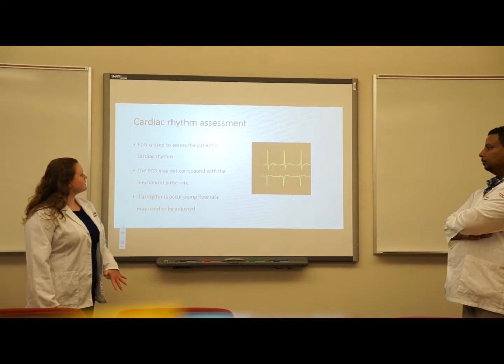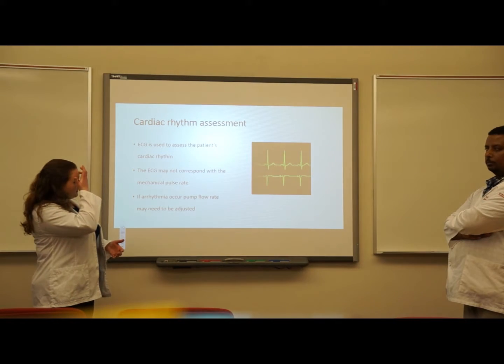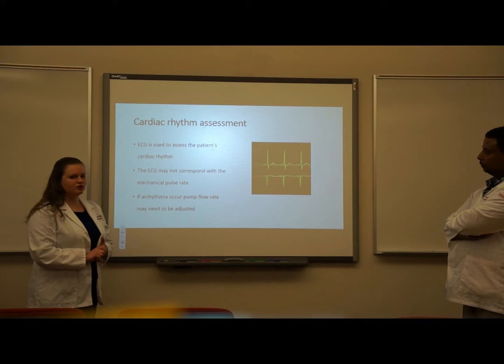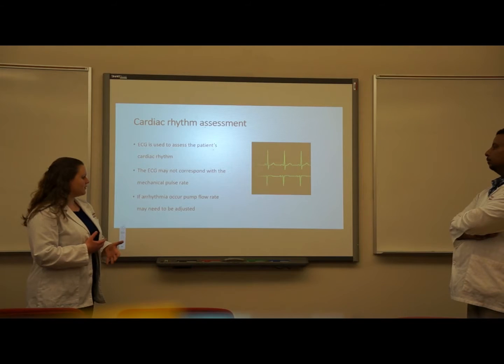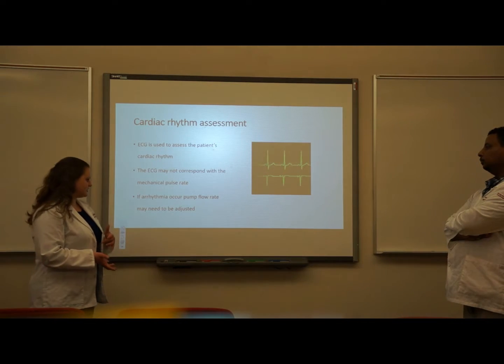Cardiac rhythm assessment: the EKG and the patient's actual heart rhythm will match up. However, the EKG may not correspond with the mechanical pulse of the pump. Arrhythmias can occur, and in that case, the pump flow rate may need to be adjusted accordingly.